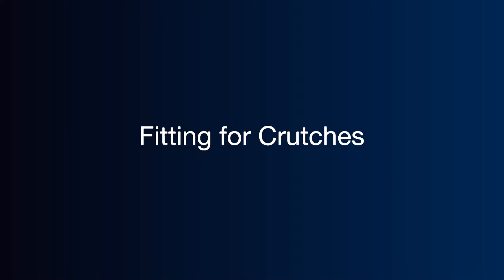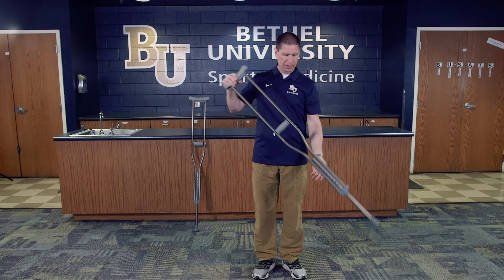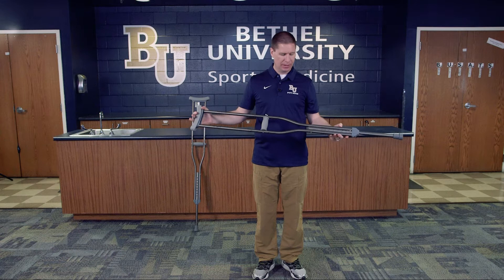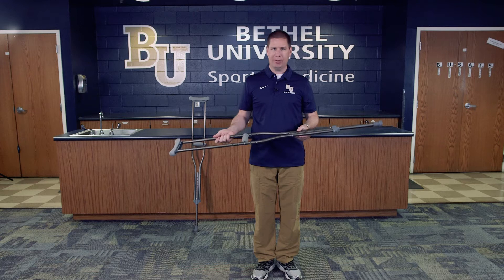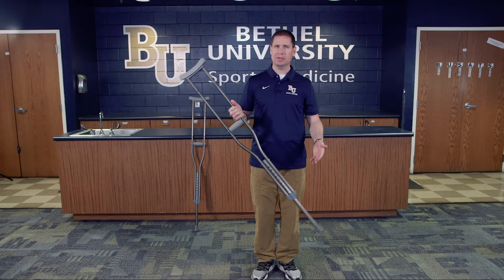This particular skill is fitting an individual for crutches. Most crutches these days are fully adjustable for a variety of different lengths. Depending on the height of the individual, you might need taller or smaller crutches. This particular size crutch fits an individual from about five foot two inches to five foot ten inches, so if they are over five foot ten inches tall you would need to get a larger set.